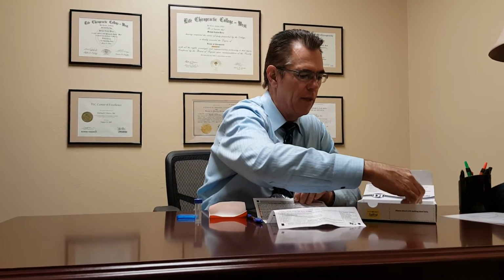And then you will collect your last sample at midnight. Get the appropriately labeled one. Get the midnight sample. Here it is. And again, fill it up to the 5 line. When you are completed with the midnight sample, throw the entire box into the freezer and let it freeze overnight.